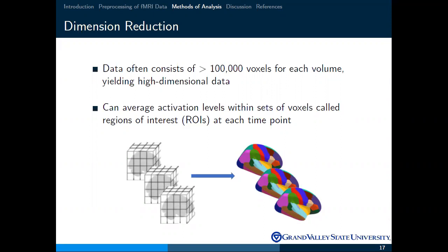How would that picture to your right look if you graphed the CV, the coefficient of variation, instead of the mean? Interesting. Right, and CV is the ratio of the standard deviation to the mean. I'm not sure. This picture is using color just to delineate the ROIs, but it's not showing the signal strength.